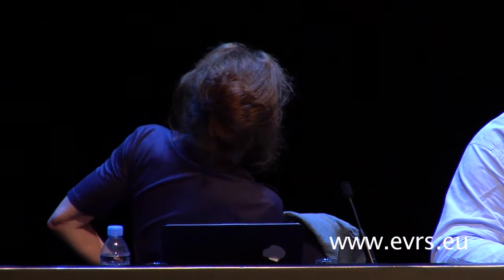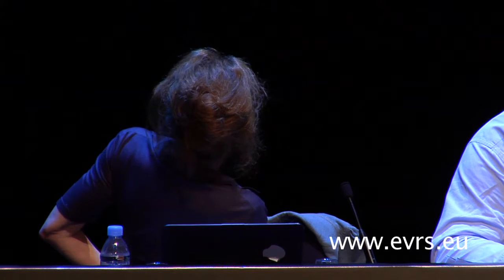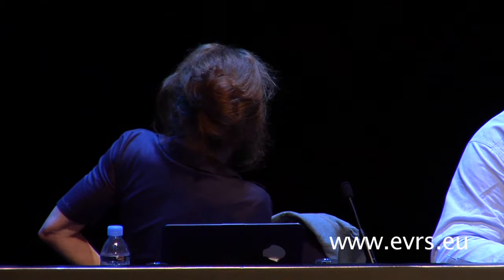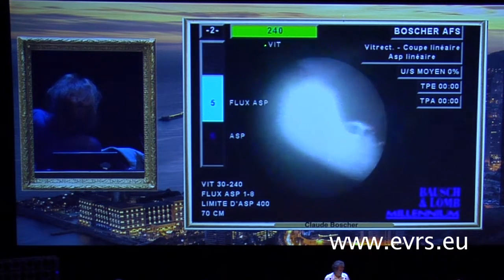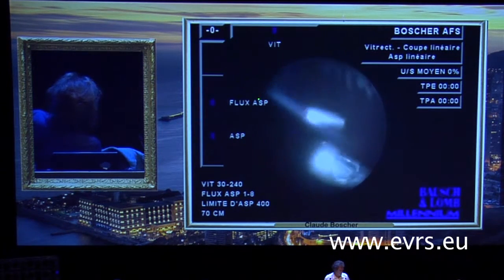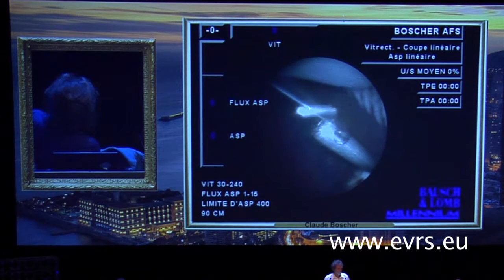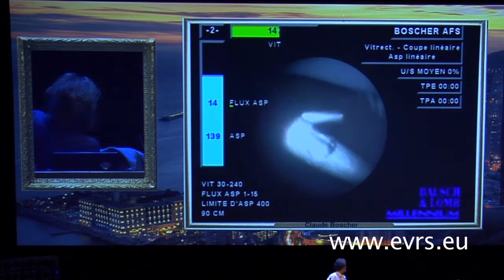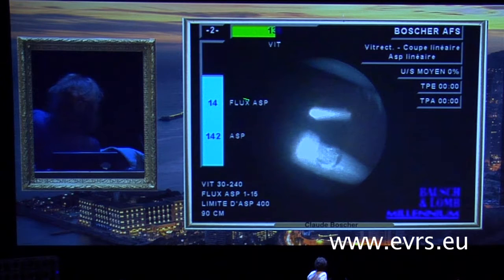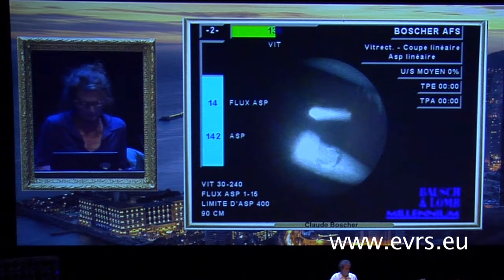And you see that here, I had to raise the aspiration flow. You're going to see I'm trying, but at 2 cc's I cannot. I have to raise it up. I think I remember up to 15 or 12 cc's with this machine in order to be able to grasp this. So you see the viscosity was extremely high in this patient because I had to raise it up to 14 cc's, which normally you do at 2 cc's.